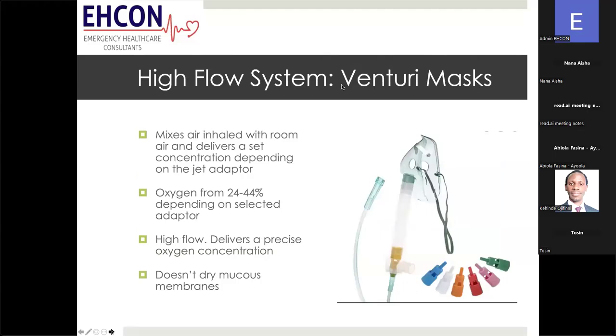We're going to shift gears to the flow systems. I'm only going to talk about a few of them. But remember that this category of system includes our non-invasive systems. They include our ventilators, whatever device you're using to deliver air from that ventilator. But I'm just going to go through a few.